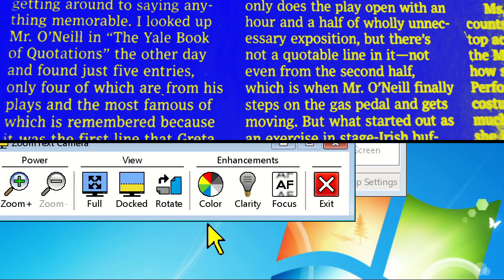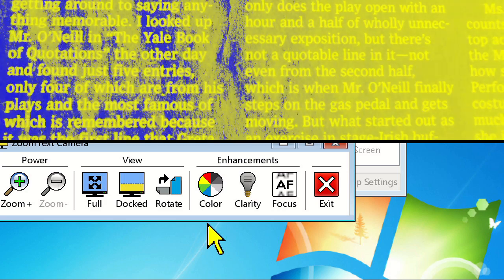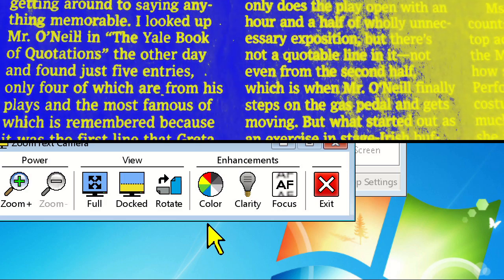We're going to show you a demonstration of what might occur if you get a hot spot from a light source showing up on the camera screen. Notice how there is a washed out area of the screen that is causing the image to be very hazy.